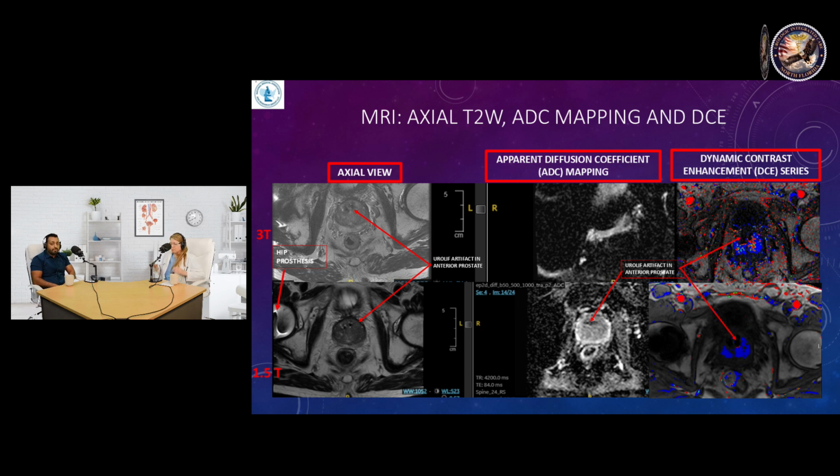They just come with the preconceived idea, hey, I want this specific treatment, and it's their choice. I counsel them very, very carefully. Listen, you will get the Urolift clips and it will work great, with good outcomes. But the MRI quality, if you need to have it in the future, is going to be altered. So sometimes those patients say, well, okay, then I want to get an MRI before. Those are subjects for discussion, but just a word of caution on using any metallic objects in the prostate.